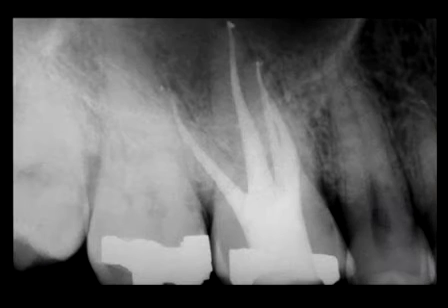Here's the post-operative film. Let's review the results. We have straight line access. We have fulfilled the 4 mechanical objectives for cleaning and shaping root canal systems. Notice the 3-dimensional pack.